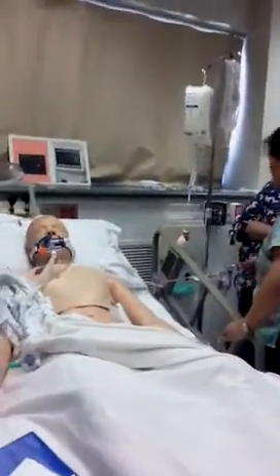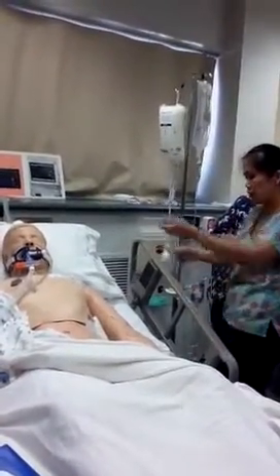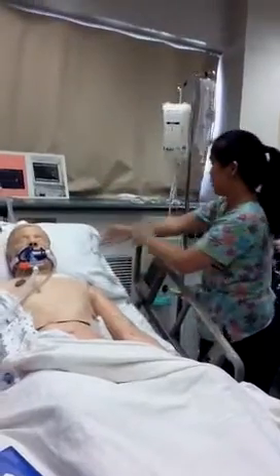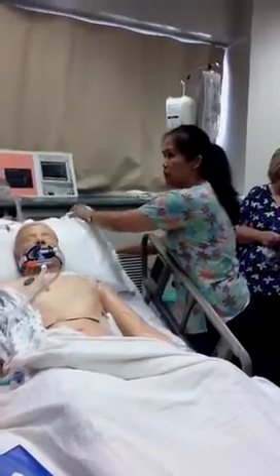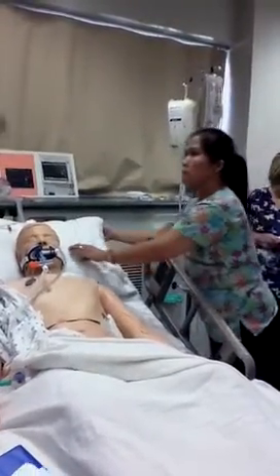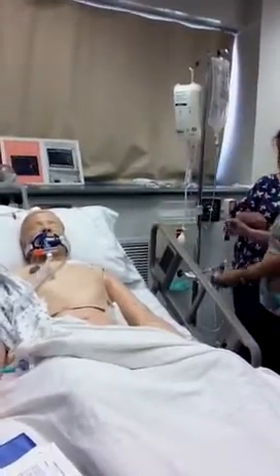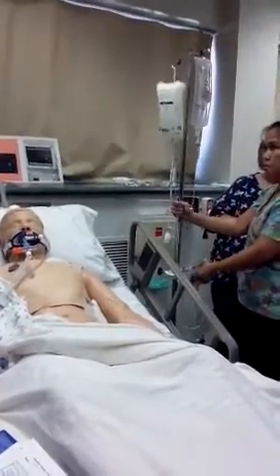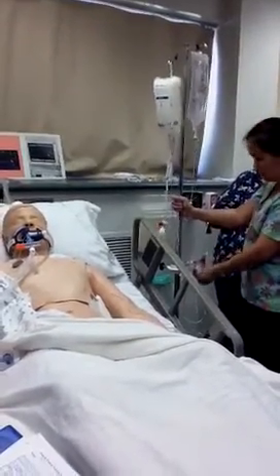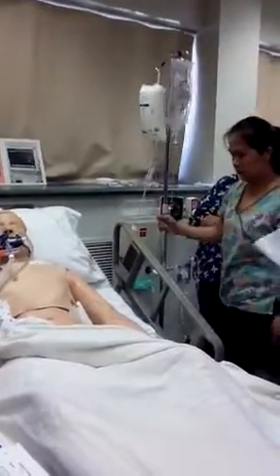So you turn it off towards the patient, you unscrew the little cap, then you zero your monitor, and it will tell you zero, so you're zeroing and negating the atmospheric pressure. What you're monitoring after everything's said and done is basically the patient's pressure. You check and make sure the pressure is good. You put a new cap on, you pull the little thing to get the waveform, and that's it. If you see this one on top, I usually say that's not right. Usually the picture will be at the bottom. Any question on that one?